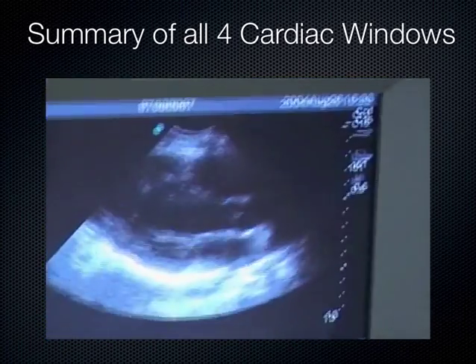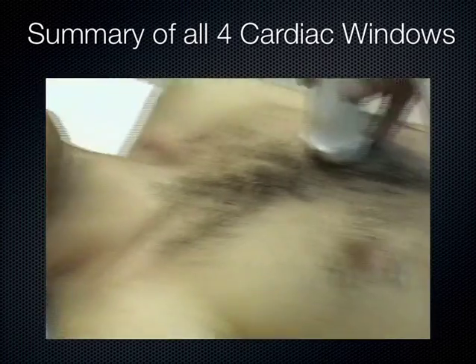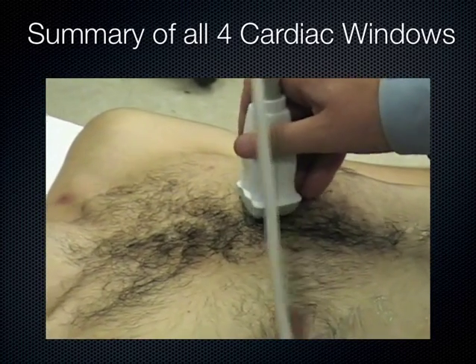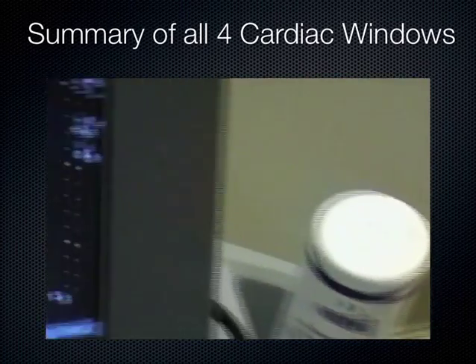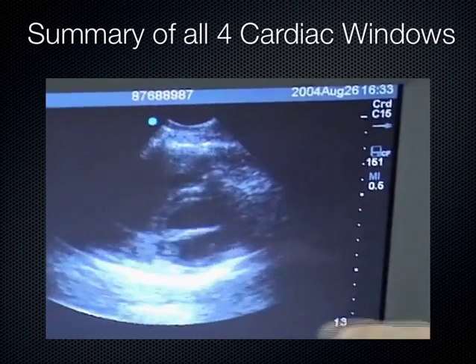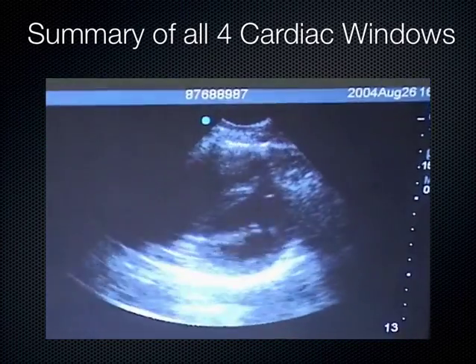If I want to do a parasternal short view, I simply take my probe and rotate it 90 degrees, and now you look on the screen and we'll see a parasternal short view. Sometimes we call this the fish mouth view right here because it looks like a fish mouth.